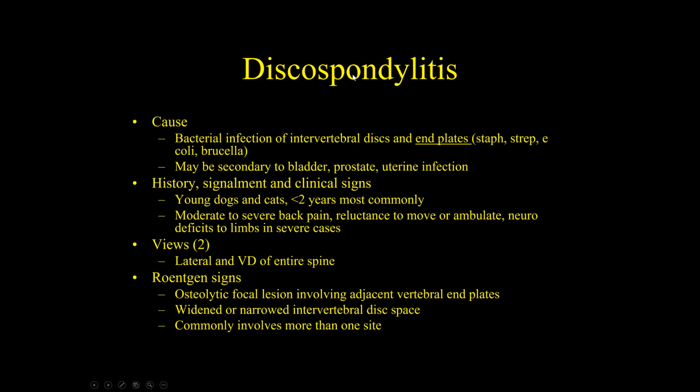Notice it does not say discospondylosis, okay? Discospondylosis is not even a word. So don't say, I think my dog has discospondylosis. I get that quite often in the history from these vets, and I politely tell them that that isn't a word. Okay. So discospondylitis is an infection of the disc.